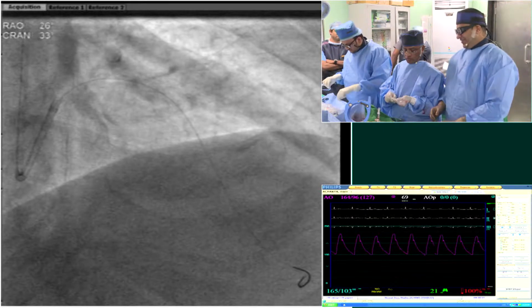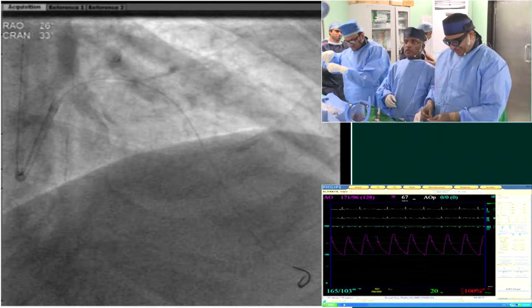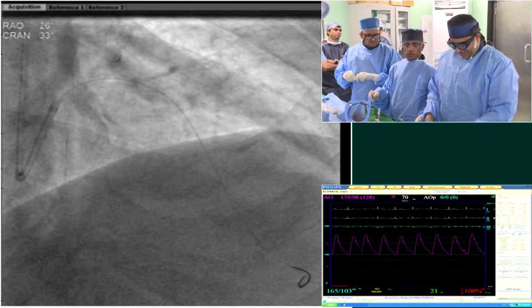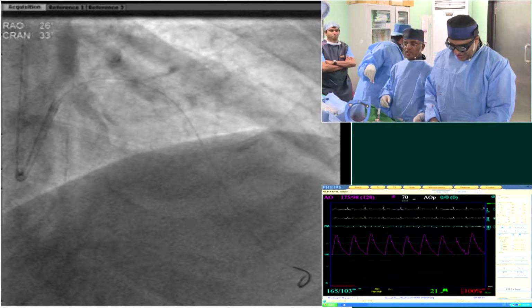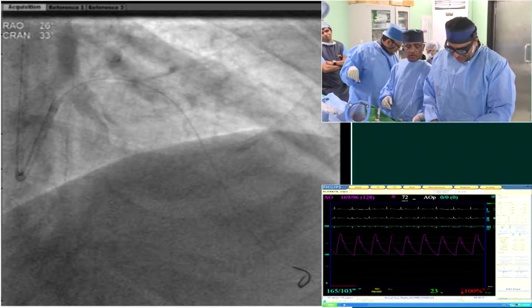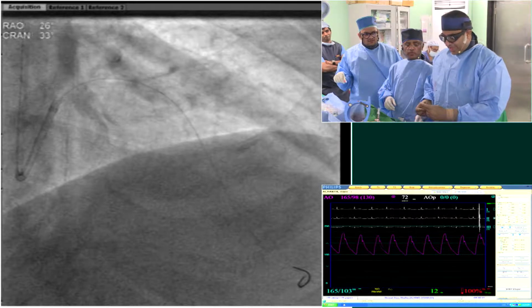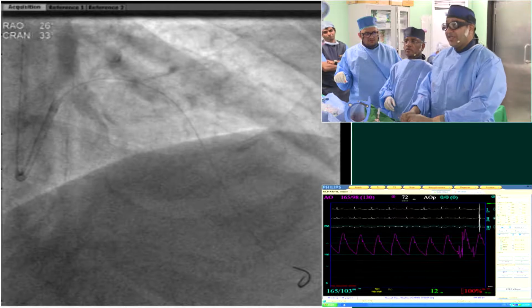So do you have your surgeon on speed dial? Yeah, he was with us. I mean, I agree with you. You've got qualified great surgeons in Mumbai, I know. Yes, we do. Actually, we did think of surgery in him also. So, to be honest, we wanted to showcase this case, so that would be the reason that we are doing this. If you personally ask me whether this lesion deserves a CABG, yes, it deserves a CABG.